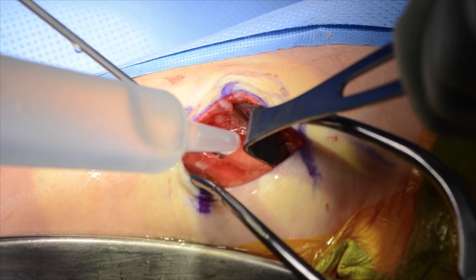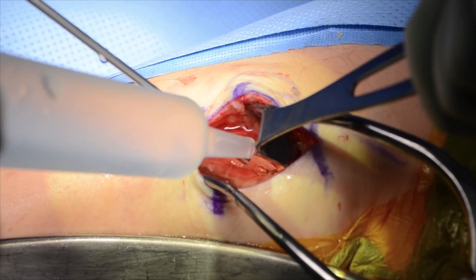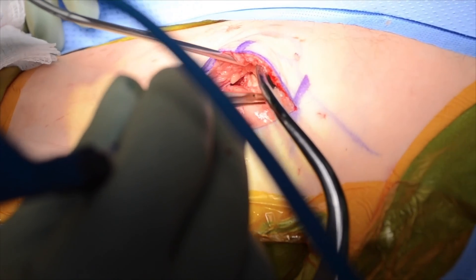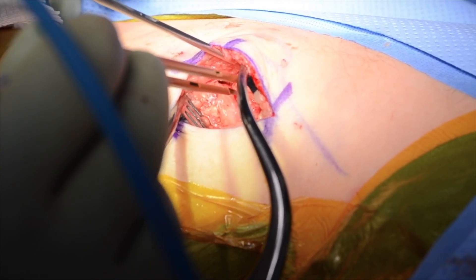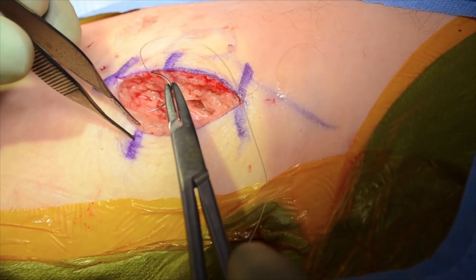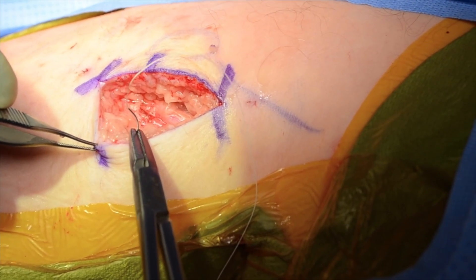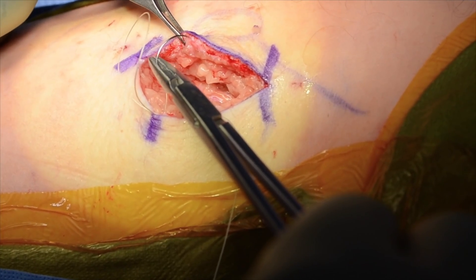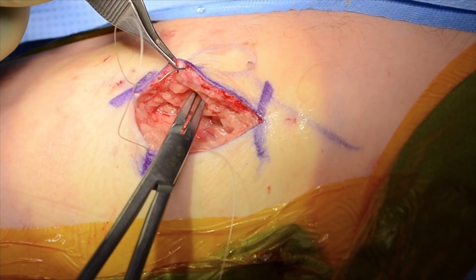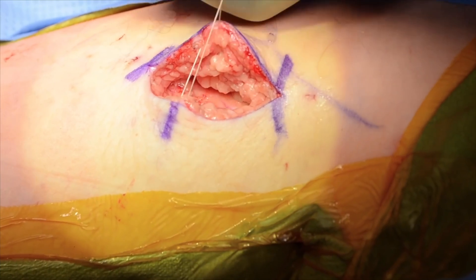The wound is then copiously irrigated with bacitracin irrigation and hemostasis is obtained with bipolar electrocautery. The wound is then closed in two layers. First, the dermis is closed using 3-O vicryl sutures thrown in an inverted fashion to bury the knot.